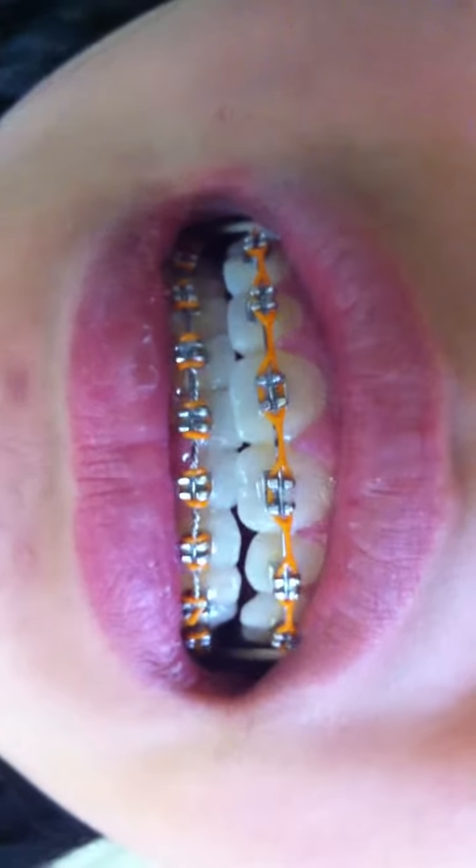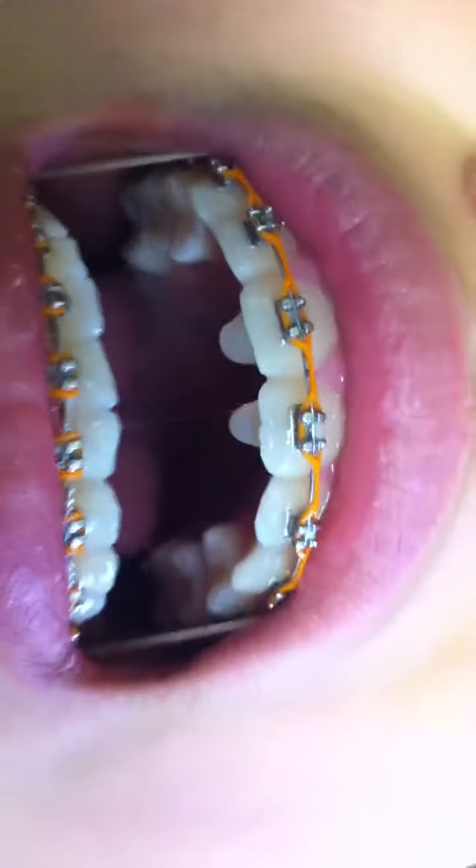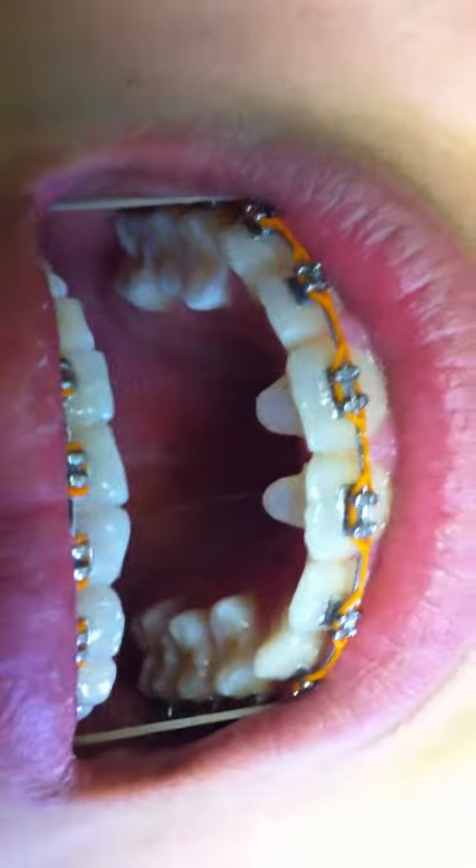As you can see, the tripod has been put in place and the teeth have been set in this position. Can you open your mouth a little bit please? You can see those little tabs — the resin tabs that we talked about.